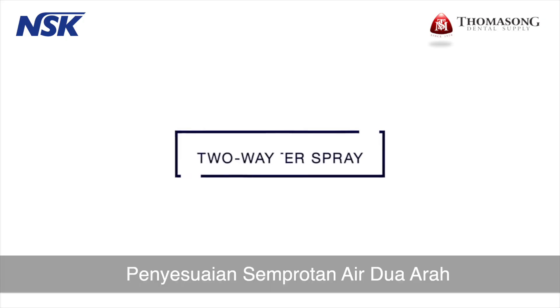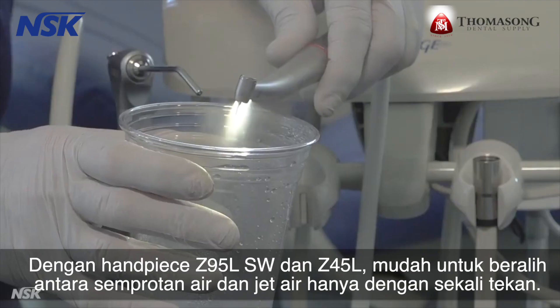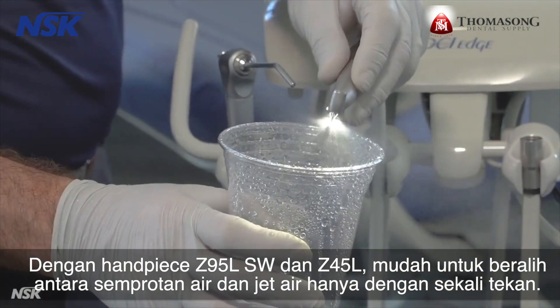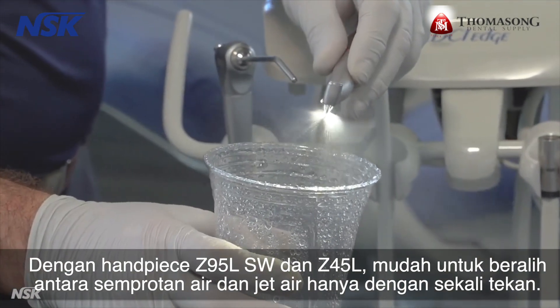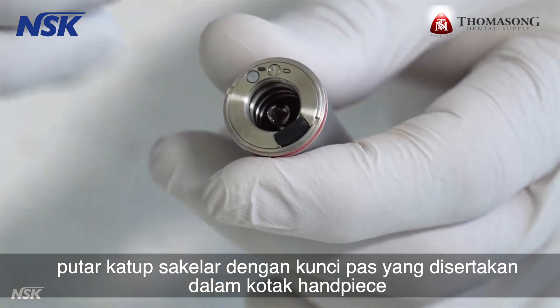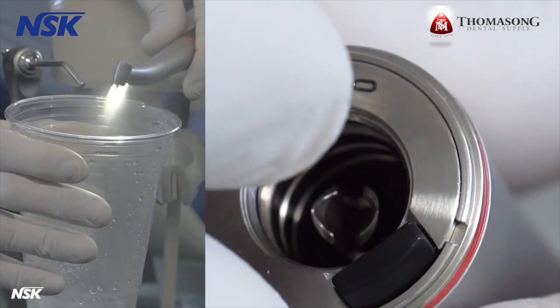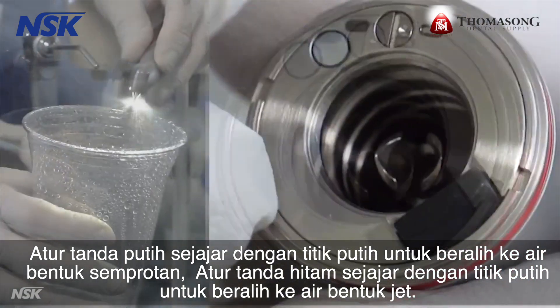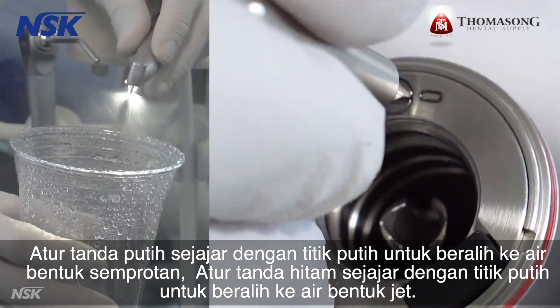Two-way water spray adjustment: with Z95L SW and Z45L attachments, it's easy to switch between water spray and water jet at the flip of a switch. Turn the switching valve with the wrench included in the handpiece box. Align the white mark and the dot to set the water spray shape. Align the black mark and the dot to set the water jet shape.